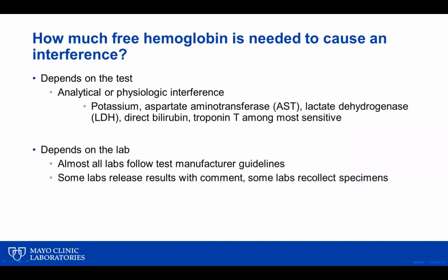So often the question we get is how much free hemoglobin is needed to generate a testing interference? And like most answers in medicine, it depends. So first, it depends on the test. All tests are not created equal when we're considering sensitivity to hemolysis.